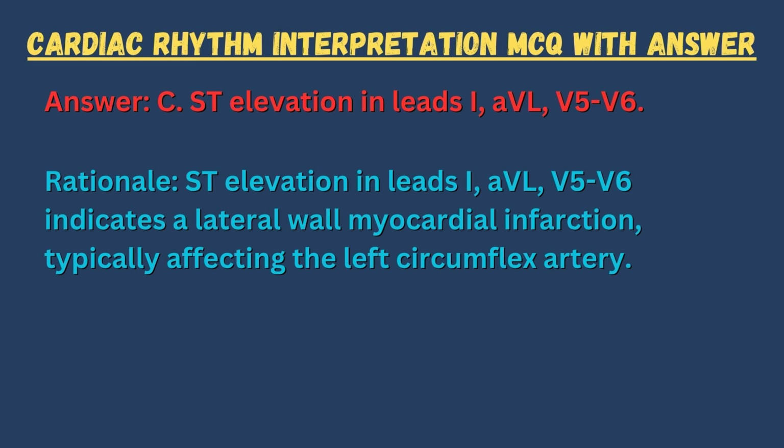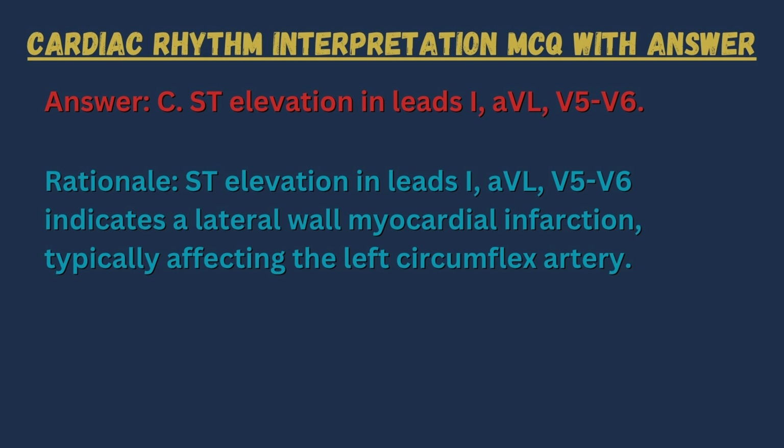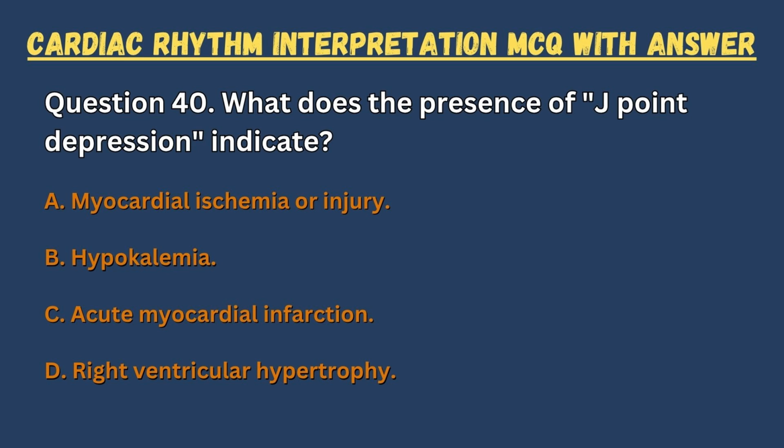Answer. C. ST elevation in leads I, aVL, V5, V6. Rationale. ST elevation in leads I, aVL, V5, V6 indicates a lateral wall myocardial infarction, typically affecting the left circumflex artery.